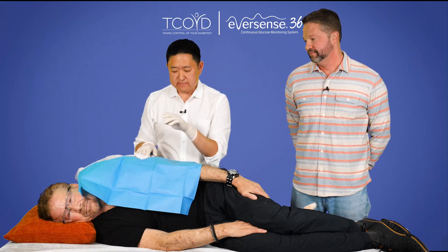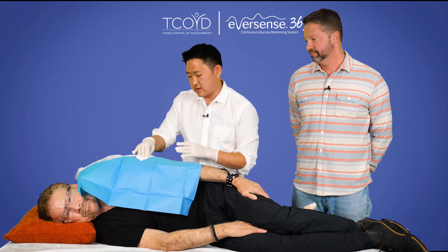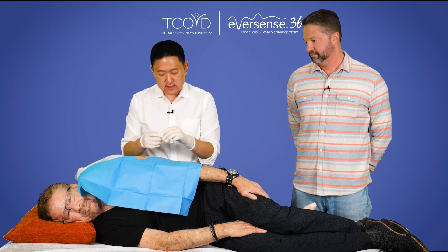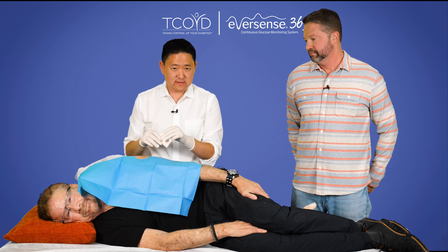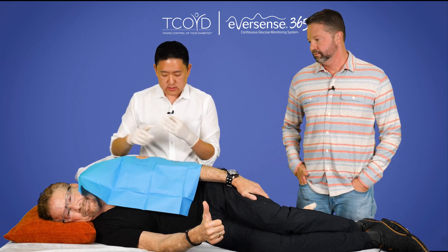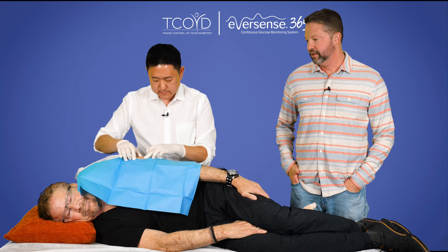All right, so we held pressure for a few minutes, and that just helps reduce bleeding after the procedure. And now we're going to use SteriStrips to close up the site. Patients are always really excited to find out that there's not going to be any sutures or anything like that. So it's just little SteriStrips. Are you excited about that, Steve?